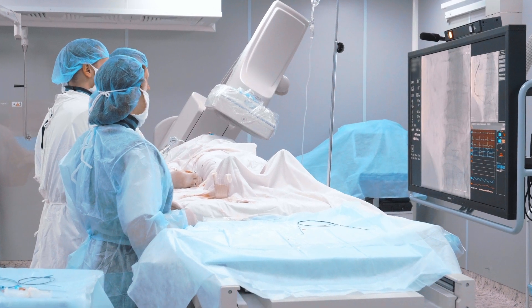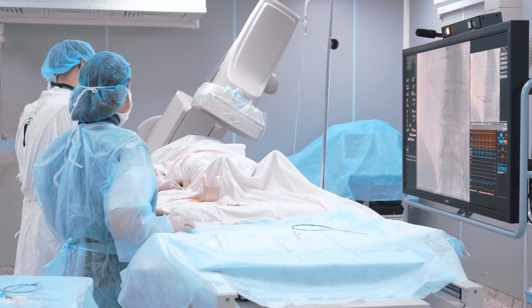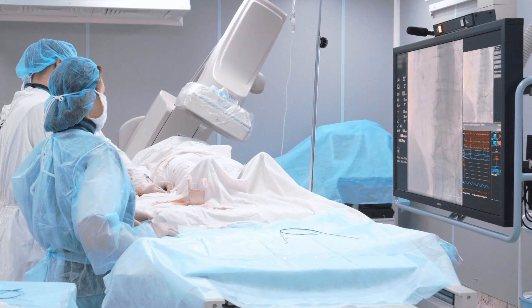The improved stability and handling of these devices increases the accessibility of complex anatomies. Building a steerable catheter shaft is a tedious process. At Zeus, we saw a way to simplify construction by focusing on the liner.